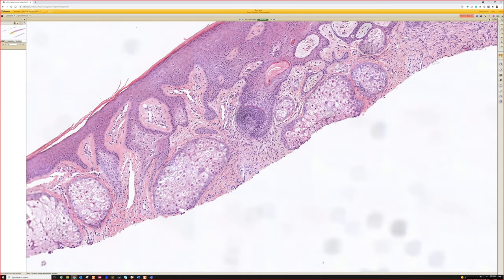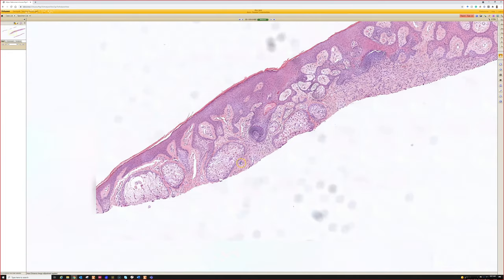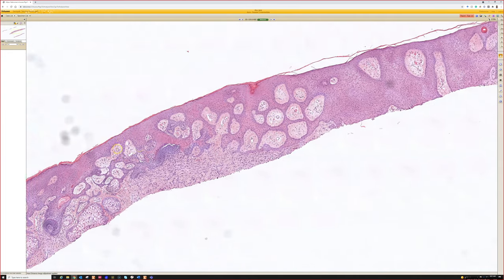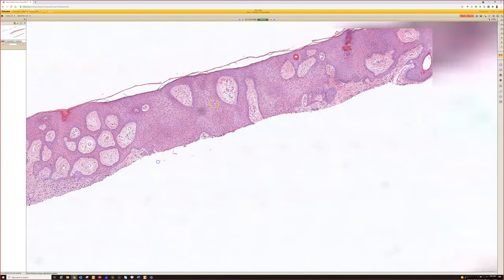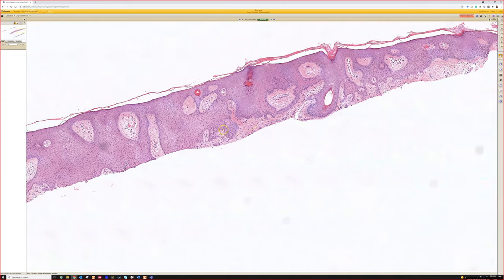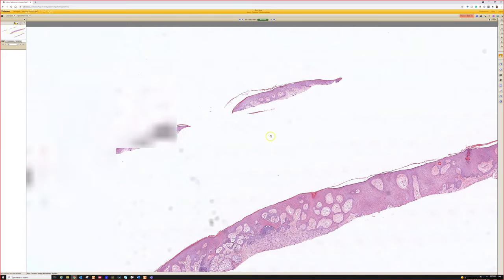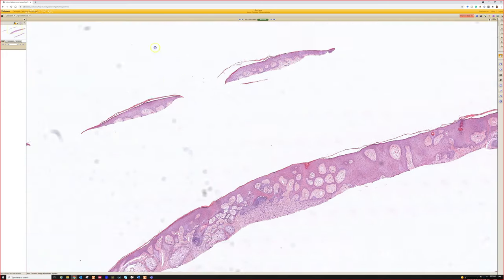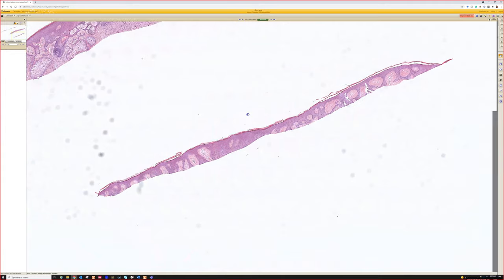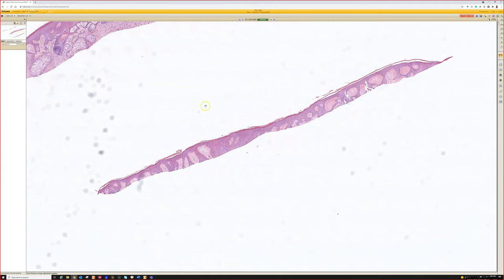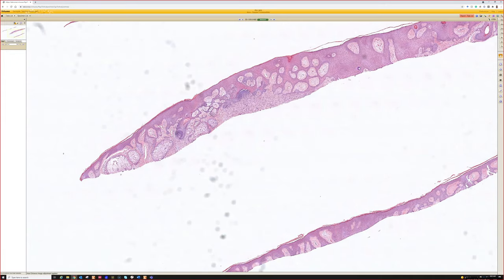There's more of the dermatofibroma right there. If you think it's basal cell but you start to see areas of acanthosis with flattening or tabling of the rete ridges, stop and ask yourself could this be the top of a dermatofibroma? That's a useful clue, though it can be hard if it's transected.